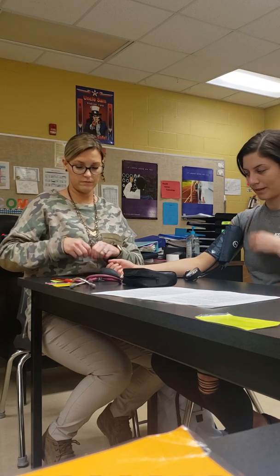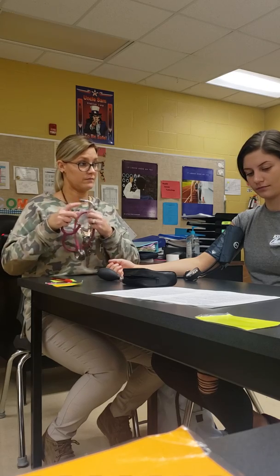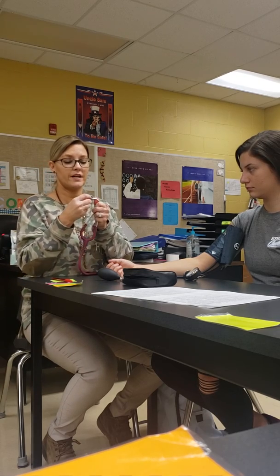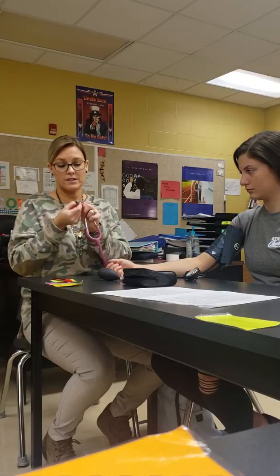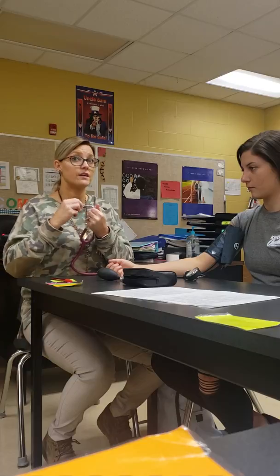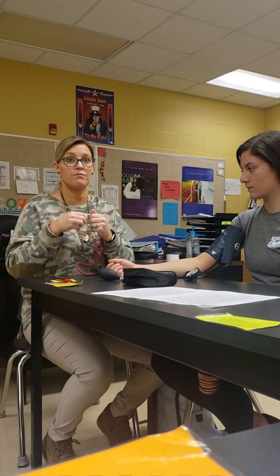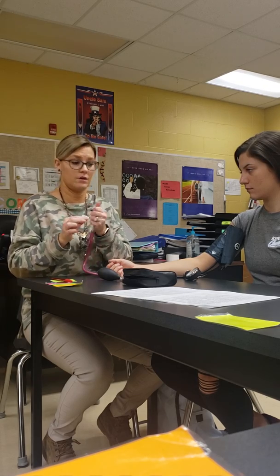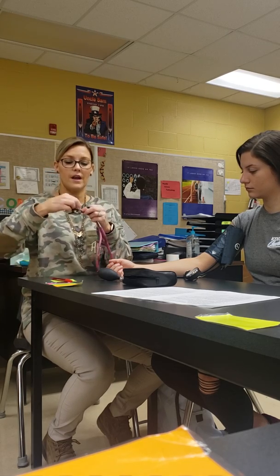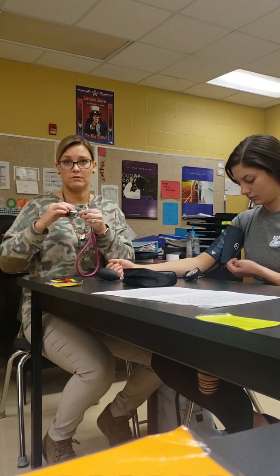Then you're going to clean the earpieces and the diaphragm of the stethoscope with an alcohol sponge. All right, I have my alcohol swab. I'm going to clean the earpieces, make sure I get in those holes real good, which you guys are always going to clean the earpieces of your stethoscope before and after use. So when you're practicing this skill over and over and over, you don't get a new alcohol swab every time. You just use the exact same side of the stethoscope, okay? So I cleaned the earpieces. I'm going to clean the diaphragm. And I typically go ahead and clean the bell of it also.